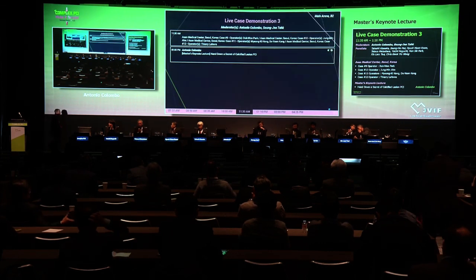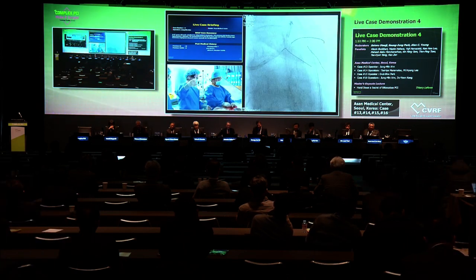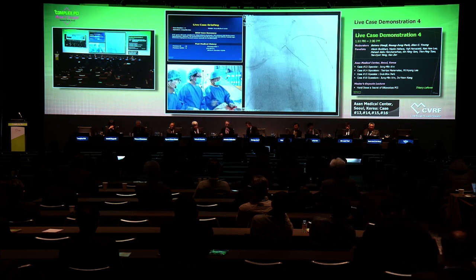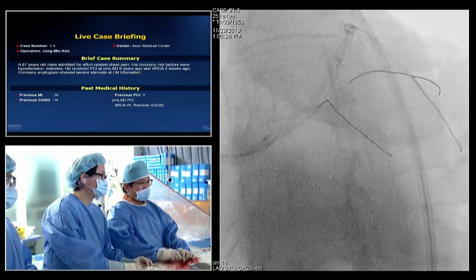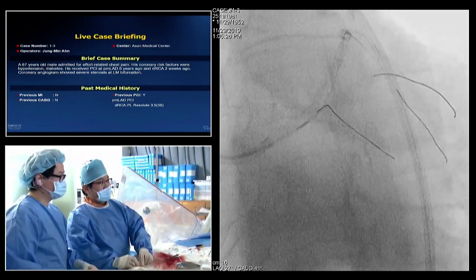Thank you, Colombo. So, congratulations. How did you manage? I will show you later. I have to stabilize the wire position first. So they say that the time is finished, but before saying hello, we would like to know how you went in, what kind of tricks did you use? Just a moment. Can we stay another 2 minutes? Okay. Sorry. No. This is an OM bridge.